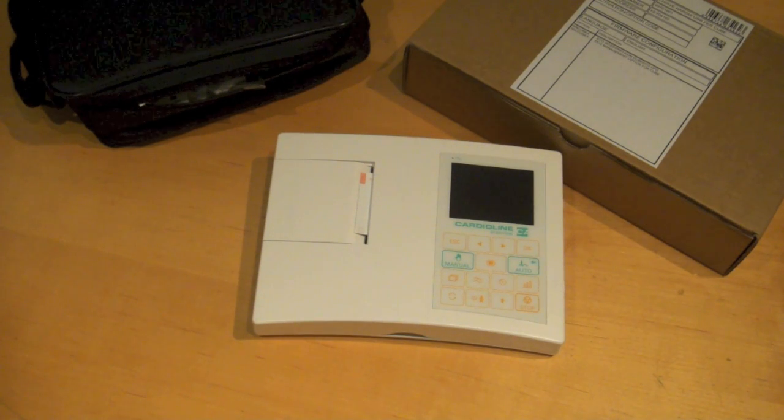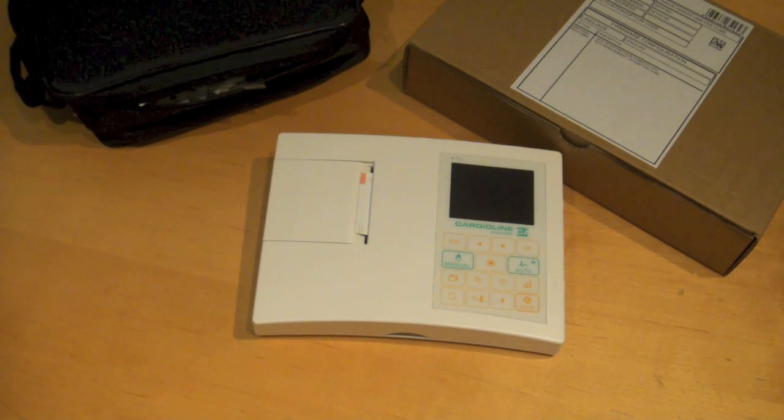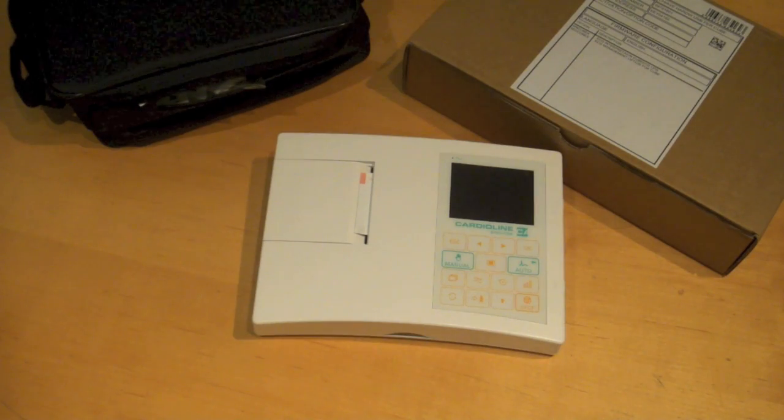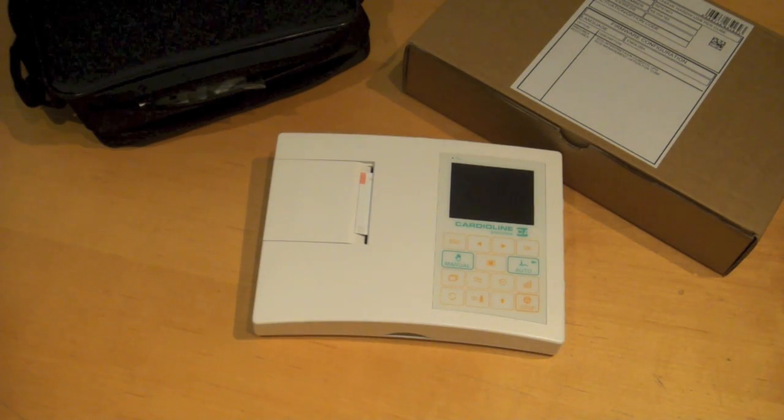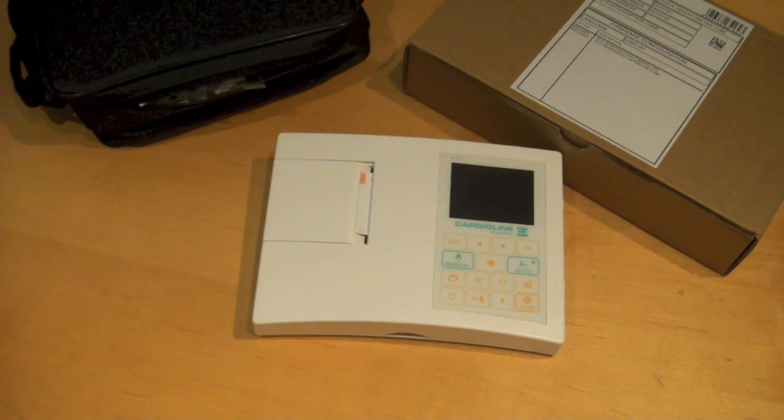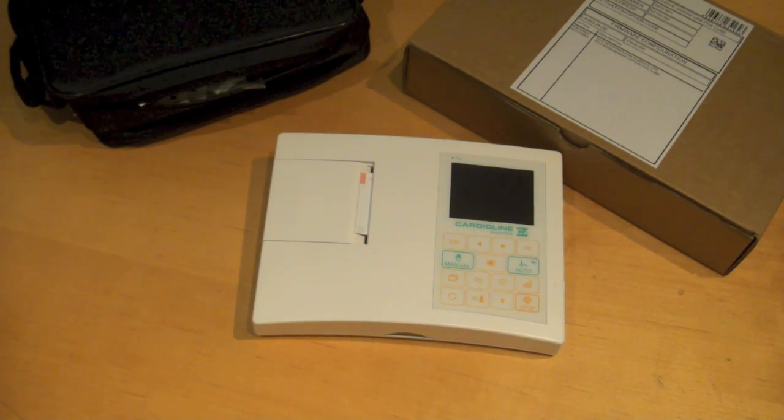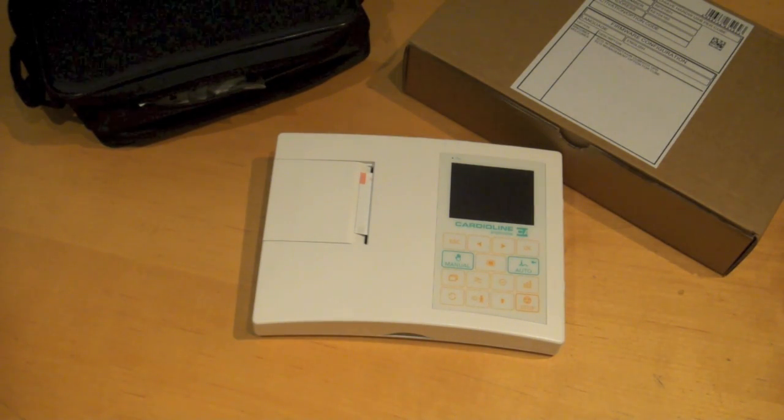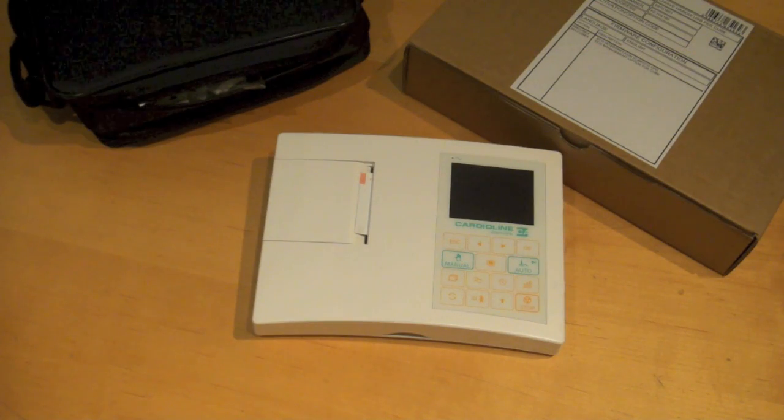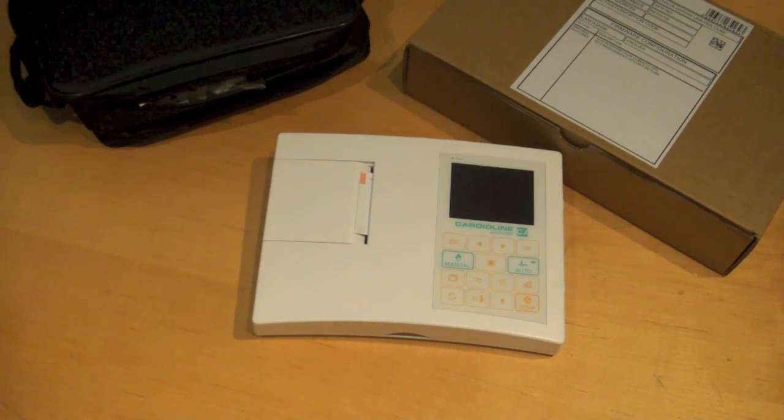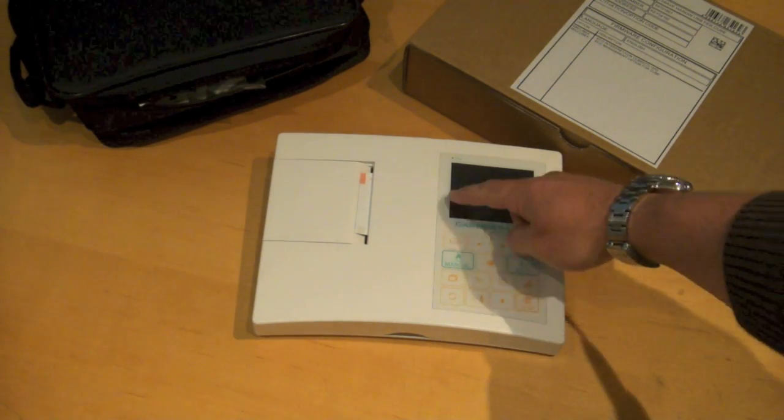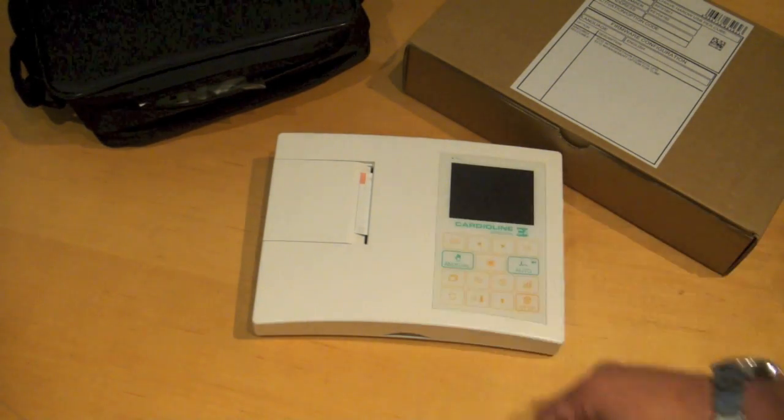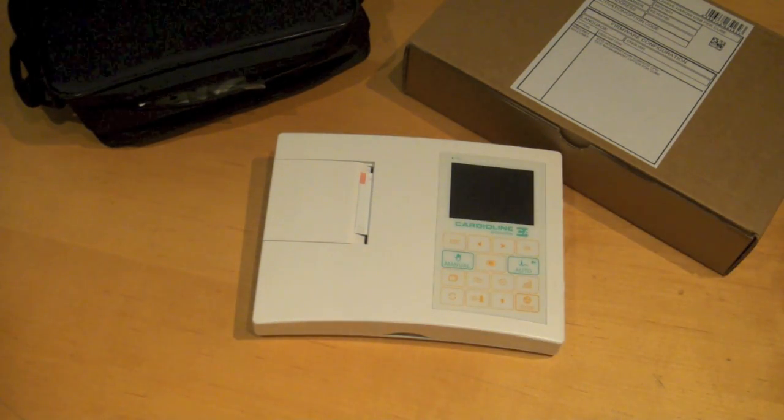Today we'll be talking about the Cardioline AR600. This particular machine comes in three varieties. We'll be looking at the AR600 view, which is the unit in front of you, which has a full preview screen to show you the waveforms.